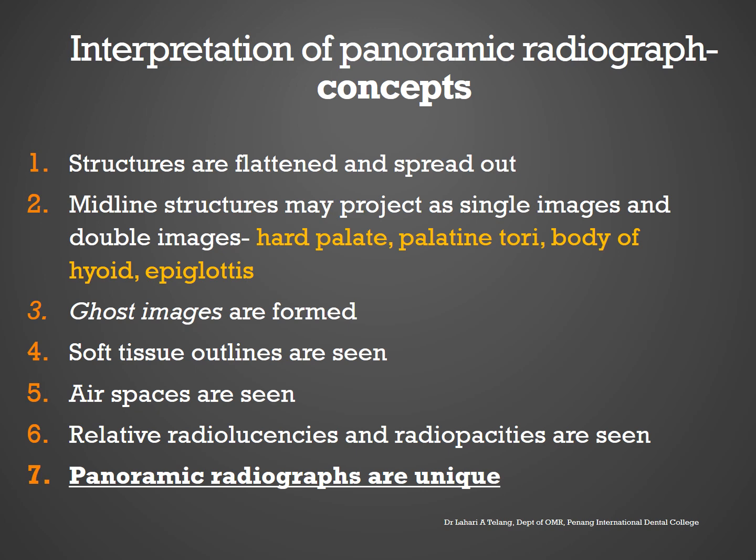Also, ghost images are formed. Let's look at this interesting part also a little later on. Soft tissue outlines are seen, air spaces are seen, and relative radiolucencies and radio-opacities are seen. All in all, panoramic radiographs are unique.